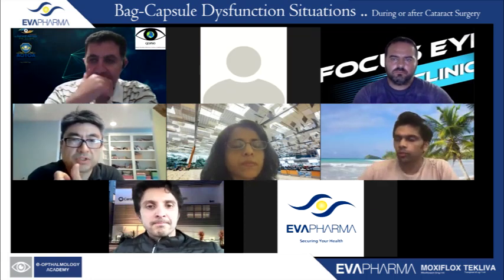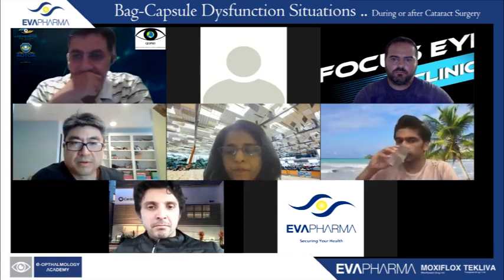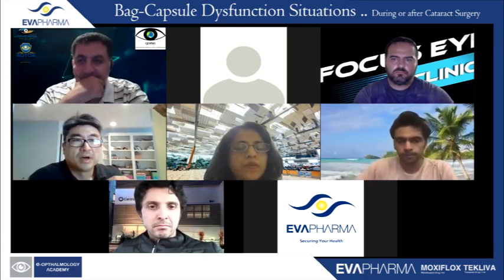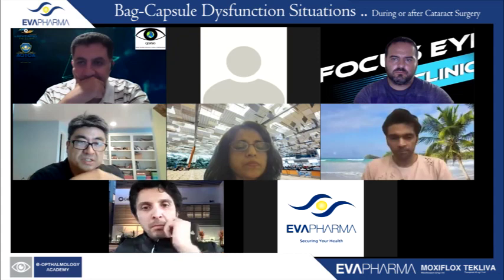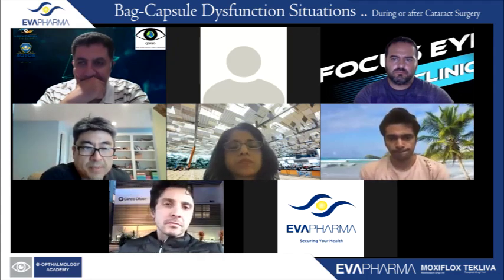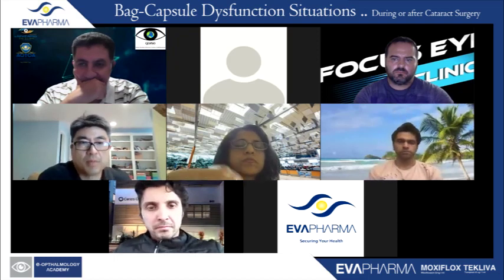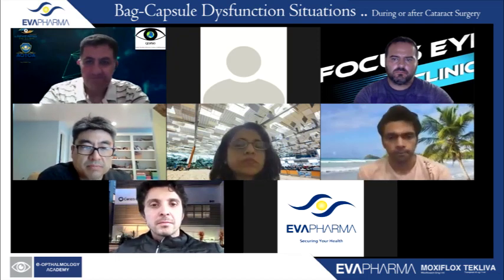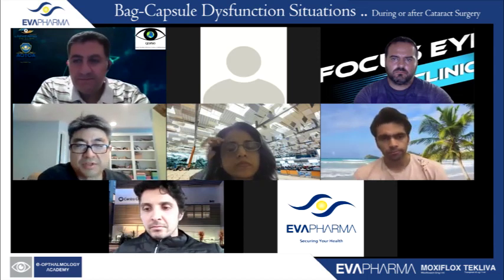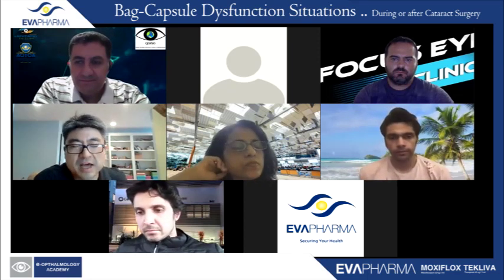So the first question about the angle, Dr. Yamani actually developed a device or an instrument where you can have a consistent approach and angle, I think about 20 degrees. But the problem with that device is it doesn't adjust for corneal diameter size, I think. So that's the challenge.